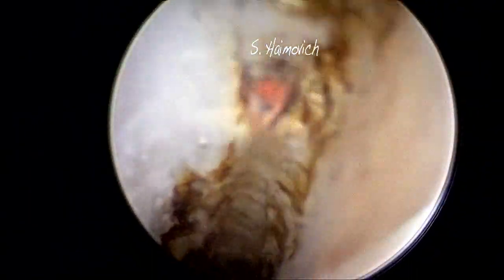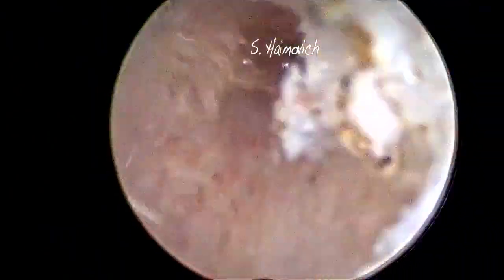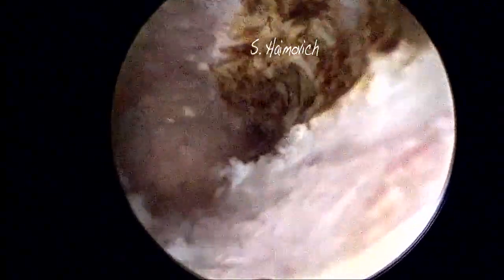Diode laser has affinity for both water and hemoglobin, meaning it cuts and coagulates simultaneously. The cut is very clean and almost no bleeding is seen. The goal is to be able to see the ostium from the internal os. Notice how smoothly and fast diode laser cuts the tissue.